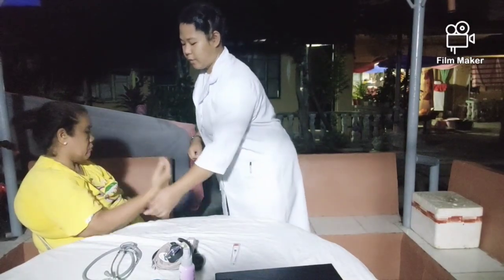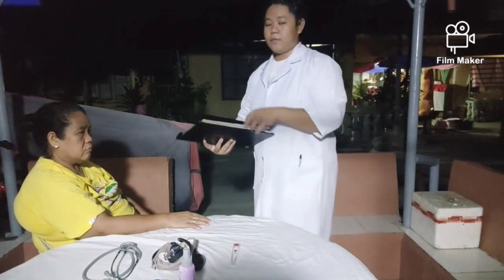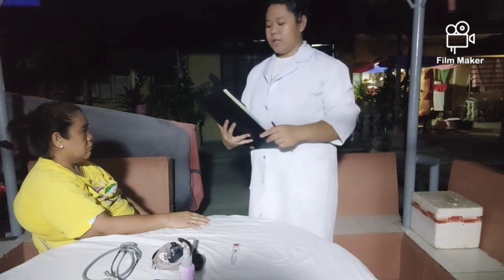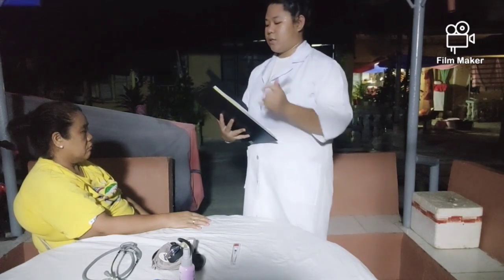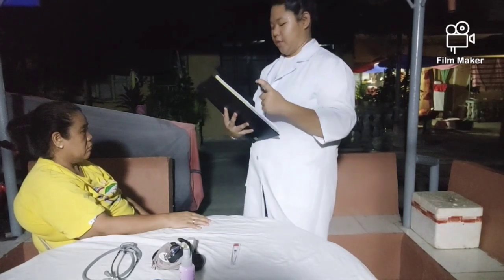Then, record the respiration rate of the patient, and while recording it, you must take note of the depth and character of the respiration of the patient.